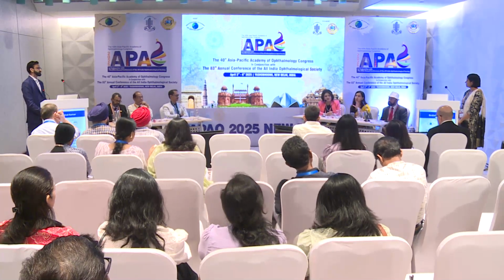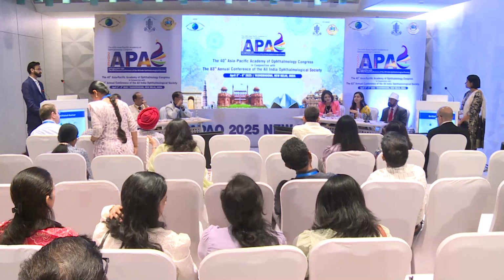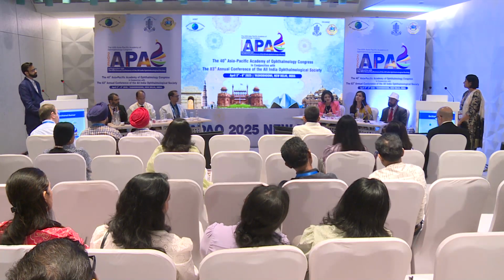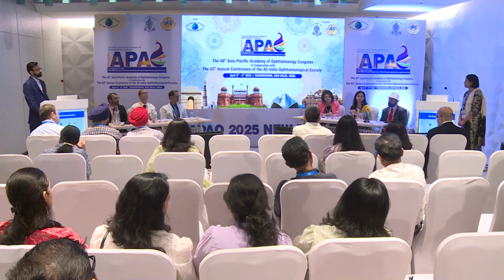And one thing which you see on your topography: if you see a cone which is very highly decentered, then that is a case where you would not want to put in a toric IOL, because very often they will not have that good spectacle corrected vision. Now you will say these patients have cataract, we don't know their best spectacle corrected vision because the cataract is there. You can ask the patient how their vision was before they developed the cataract, and they'll know if there was a drop in vision, right?